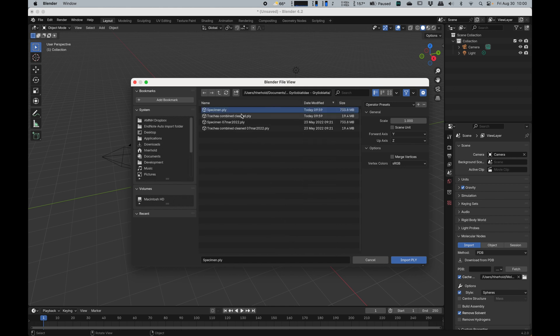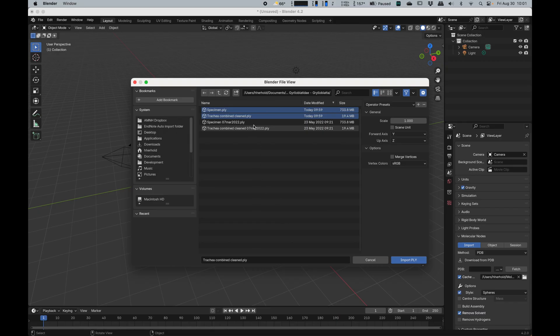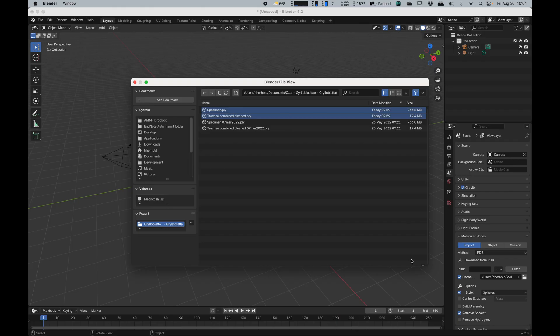There is my specimen, my trachea combined cleaned. Those are the two. These are older models that I created before. These are the ones I did for this demonstration. I say import PLY.